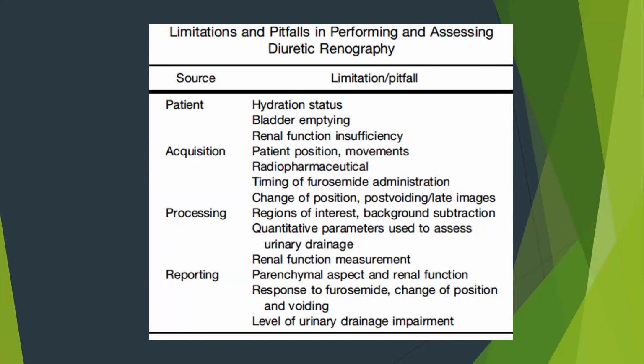Talking about the acquisition parameters, the patient position or movements affect the study, or the choice of radiopharmaceutical, the timing of Lasix administration, and the change of position or post-void or late images are limitations in which we can have different results, and it can hamper the quality of reporting.